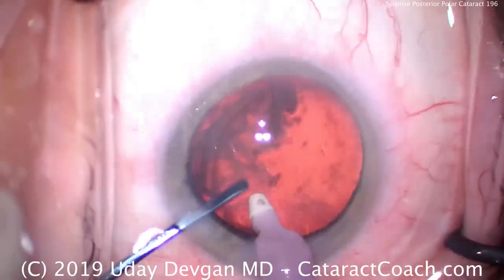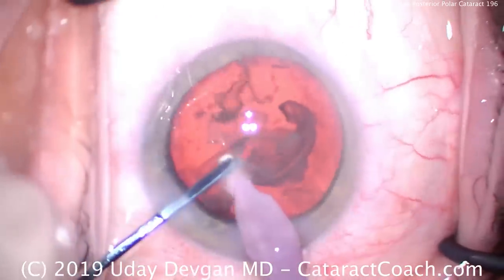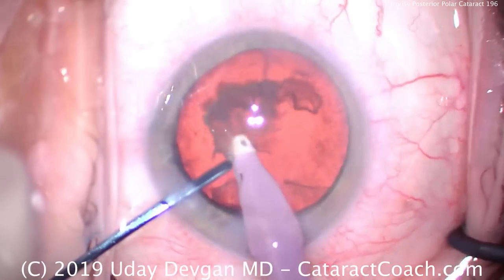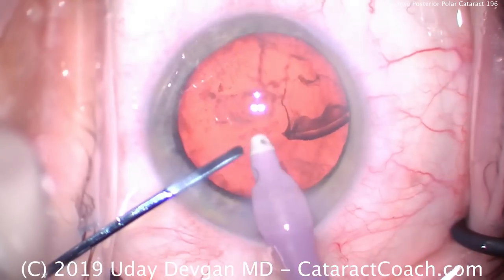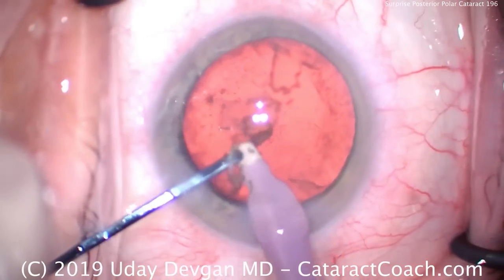If you try to remove that central plaque off the posterior capsule, it can — in a second — pop the posterior capsule wide open. So instead, let's remove this epinuclear shell and the other fragments we can. I'd rather place the lens in the capsule bag and then have the patient get a YAG capsulotomy a month or two later. That's a much better option.